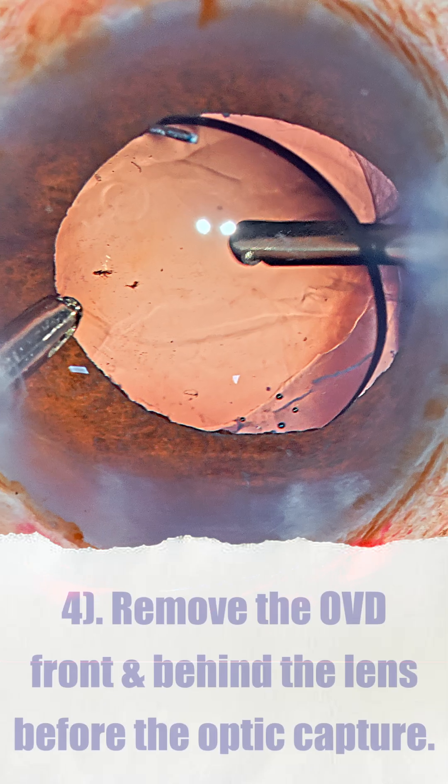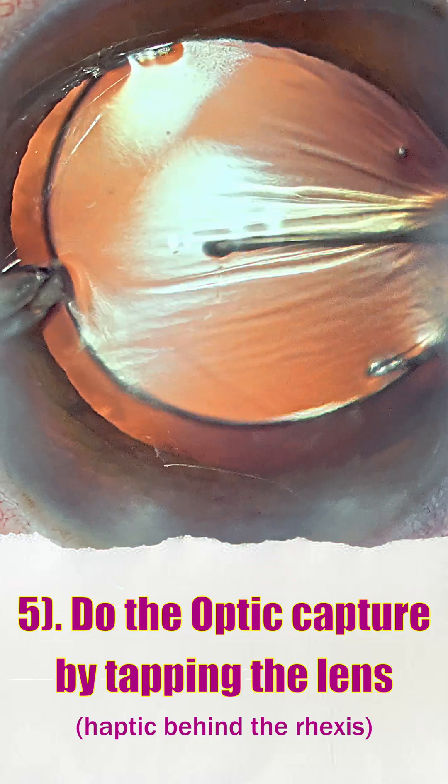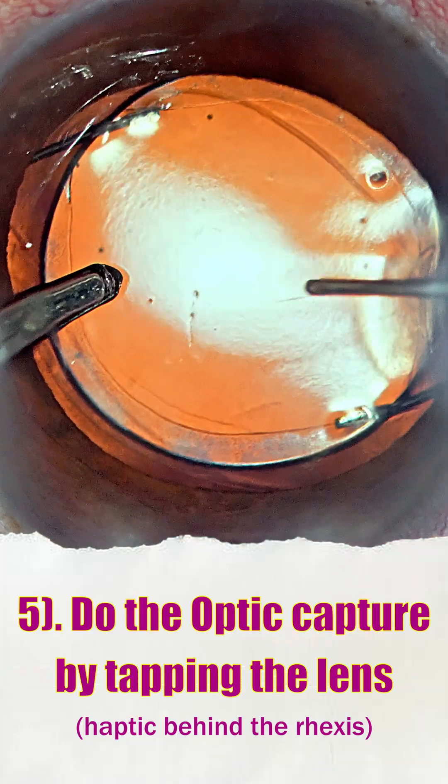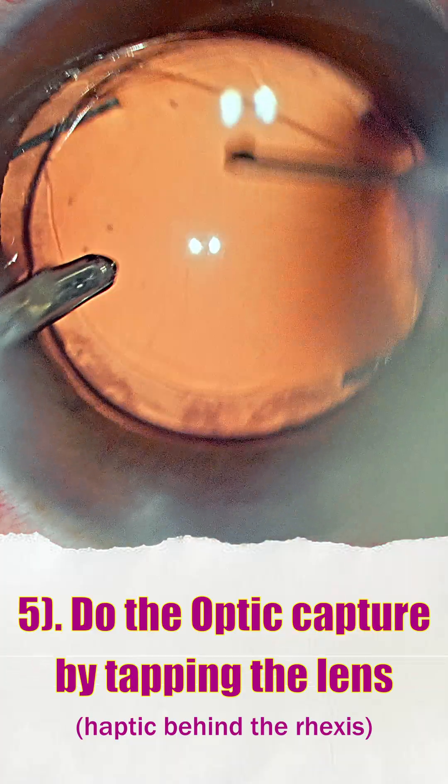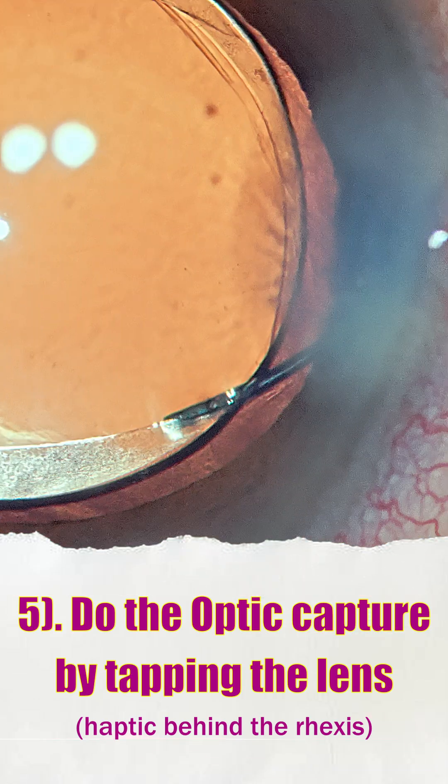Remove the OVD both in front and behind the lens before achieving an optic capture. Finally, once the OVD has been removed with irrigation still on in the left hand, using a Sinskey hook and just tapping the lens posteriorly will ensure that we have a good optic capture.